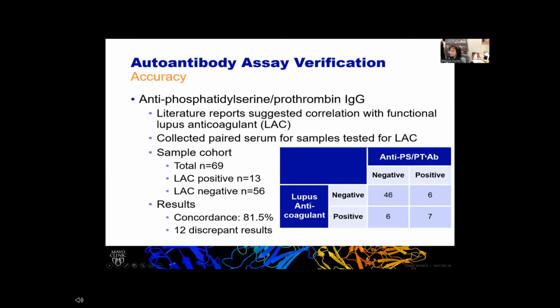But the point here is that, again, we were trying to assess accuracy of our IgG phosphatidylserine prothrombin by comparing it to a related test. And sometimes this can be useful information, but it also can be sometimes difficult to understand when you see discrepancies between the results.